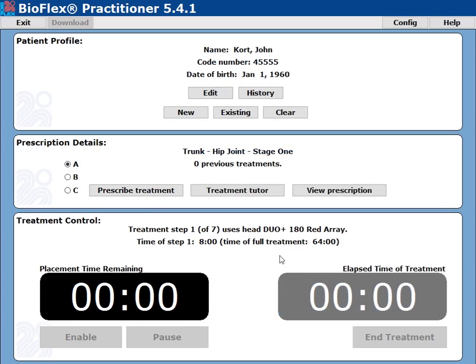Now, because the patient is African Canadian, darker skin, technically, if we put in that patient factor, we would have had approximately an extra 12 minutes, so approaching almost 76 minutes of time, so a lot more time. We can avoid that by customizing the protocol instead.